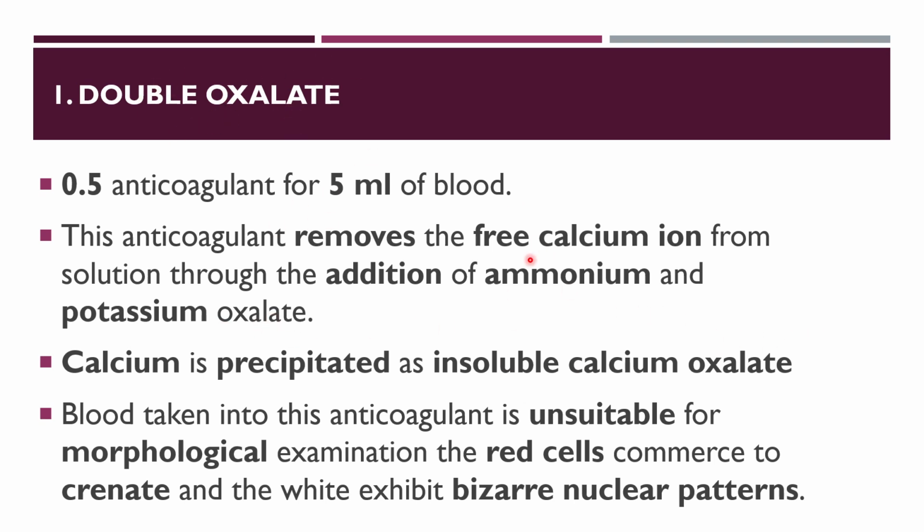Basically, this double oxalate is used for specific tests such as the ESR method using Wintrobe's method, and packed cell volume determination.